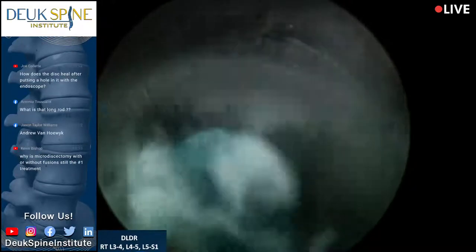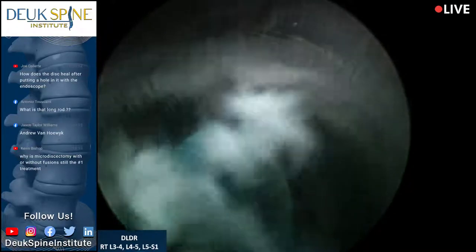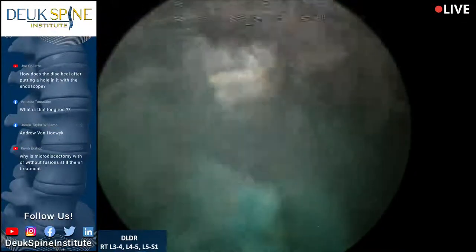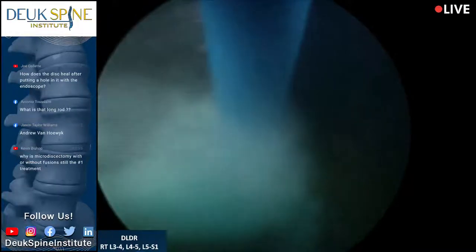All right. We're going in with the laser fiber. We probably need about 15 minutes, doctor. We'll be done. Our patient is nice and comfortable sleeping.